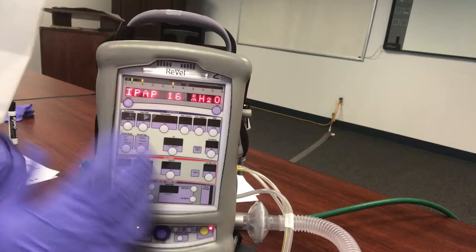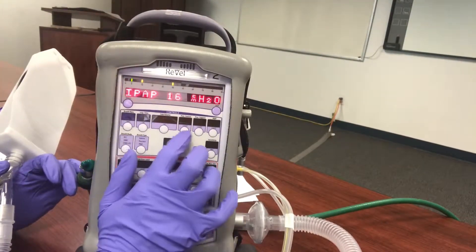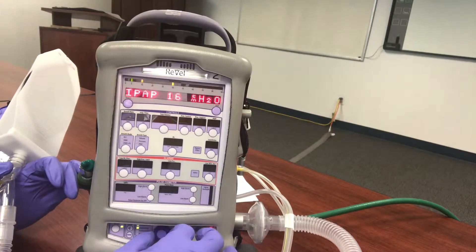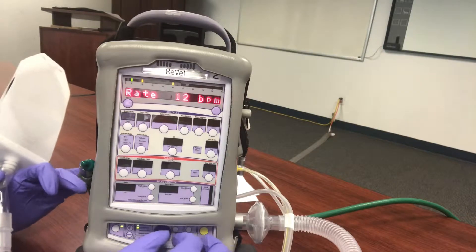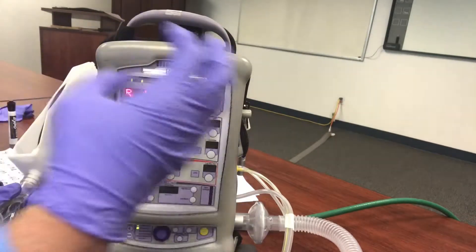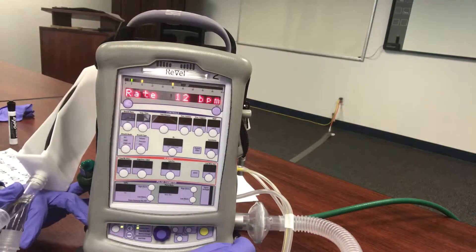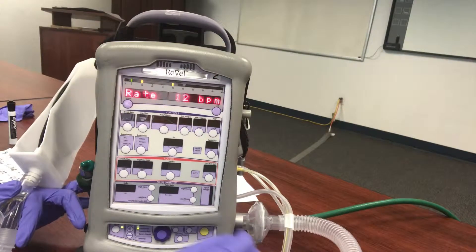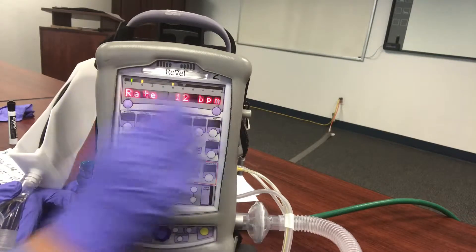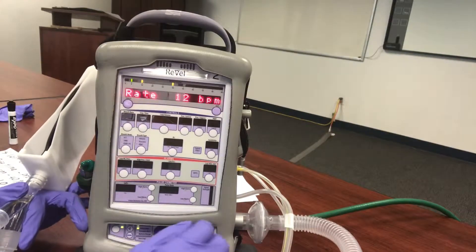Once the patient is on it, I'll show you how to adjust — this setting won't come up again; you'll have to adjust from pressure control. So we have 16 over 5, and then we have our backup rate. The backup rate is not a ventilator, so it's not going to deliver mandatory breaths. What the backup rate does is: if our patient goes apneic in this spontaneous mode, it will nudge them to take a breath — making sure they breathe at least 12 times per minute, or whatever you set the backup rate to.